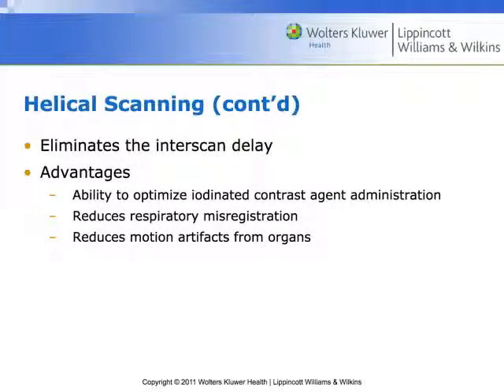So probably the future of CT, I think we've talked about this a little bit, is moving towards things like 3D printing and stuff like that, generating things like facial reconstruction models and hardware out of the CT data sets. So being able to harness this volumetric data set is significant for a lot of reasons.